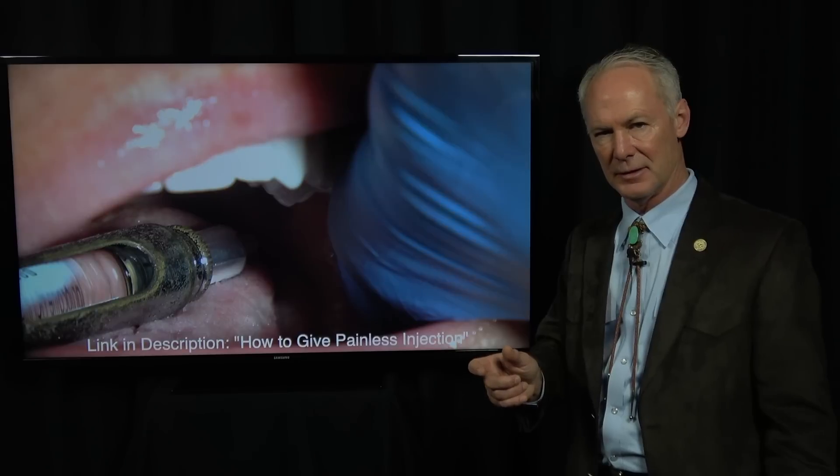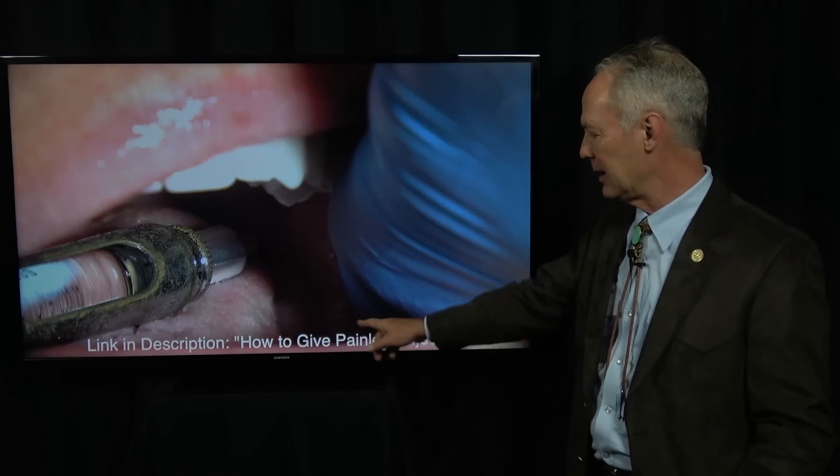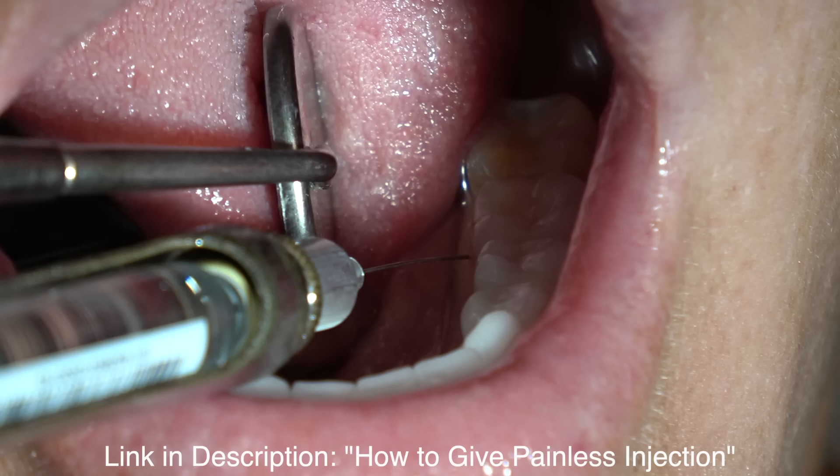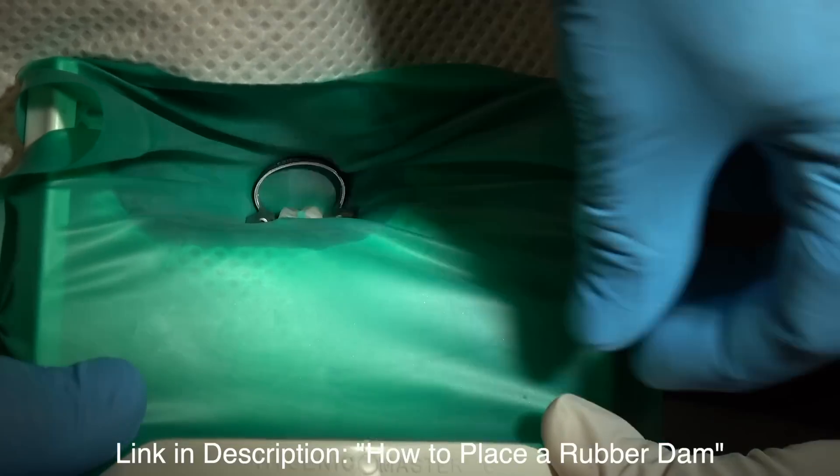Always give an intrasulcular injection and refer to that Dental Minute or Dentistry Master Classes video on how to do that. Here's the intrasulcular. We're placing a rubber dam.